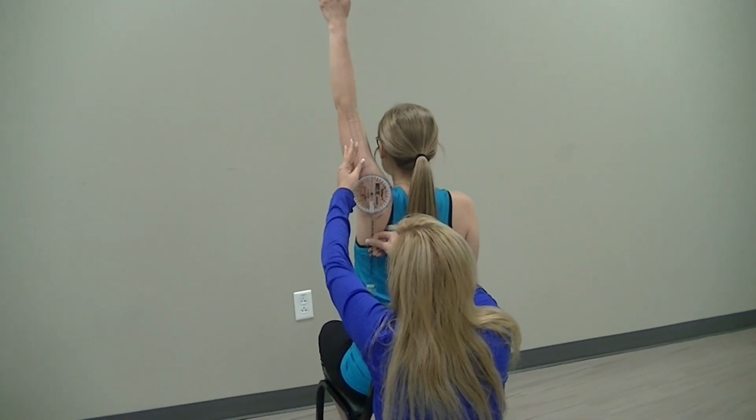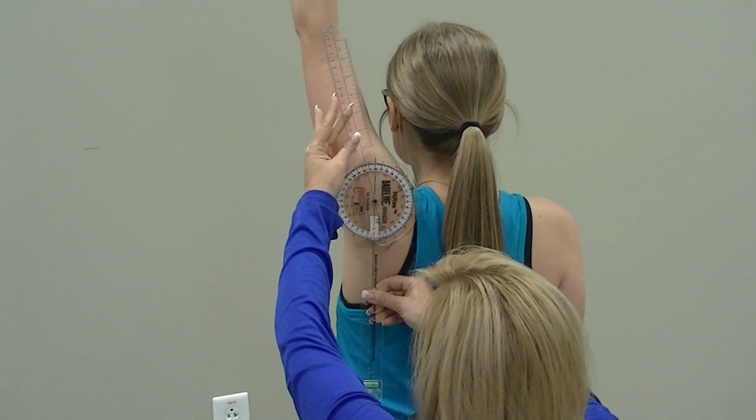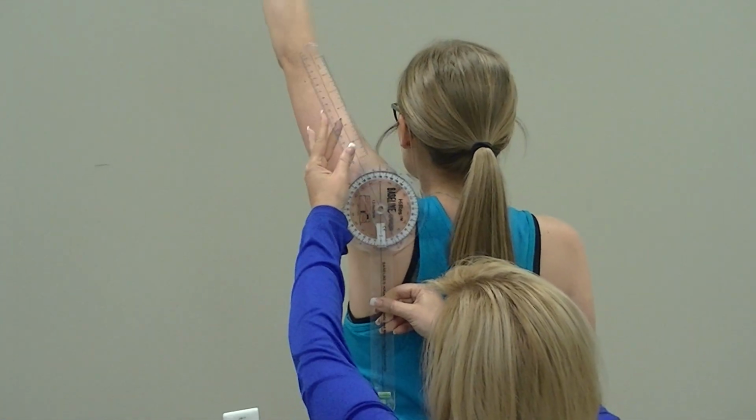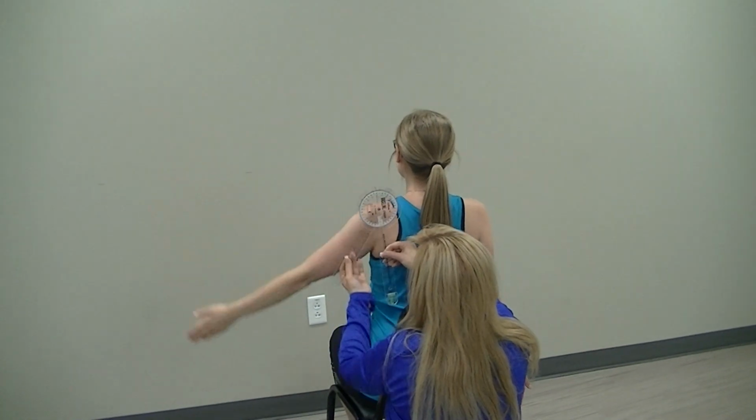Check for proper positioning of the goniometer and for substitution patterns, which can include lateral flexion of the trunk and shoulder flexion. The norm for shoulder abduction is 0 to 180 degrees.